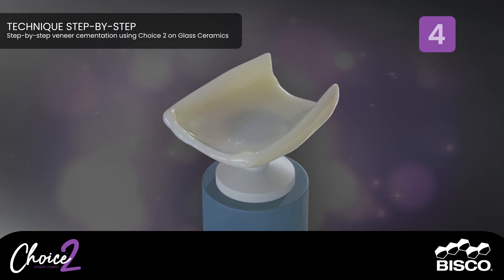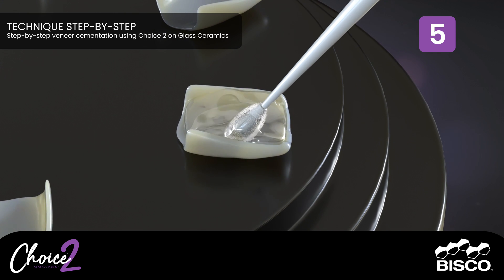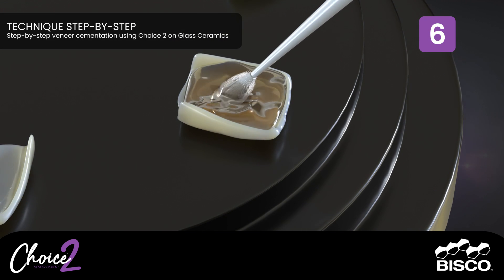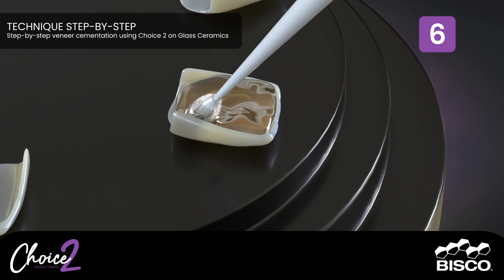Rinse with copious amounts of water and air dry. Step Five: Apply bissilane to the internal surface of the veneer and allow to dwell for 30 seconds. Dry with warm air syringe. Step Six is optional: Apply a thin layer of porcelain bonding resin to the internal surface of the veneer. Do not light cure.